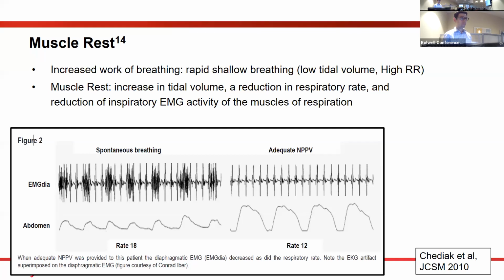So you put it in the intercostal space. You'll see the early paper recordings. So you put an EMG here, but it doesn't really work out because you can't get that through. You put it over what they call the zone of apposition, which is between the diaphragm and the rib cage here. So there's another way of doing it. We don't do it very well, because we don't swallow balloons.